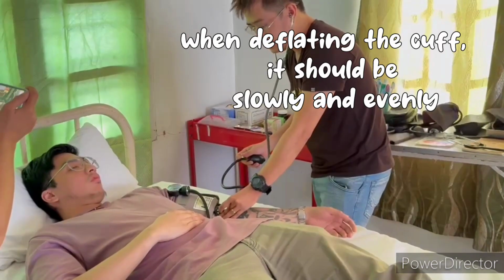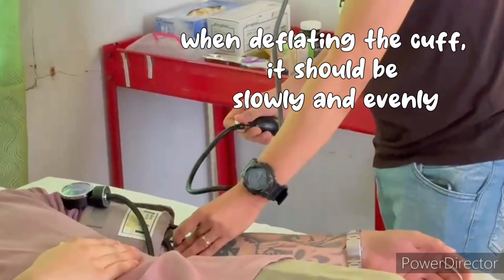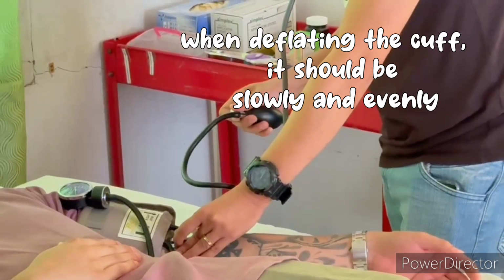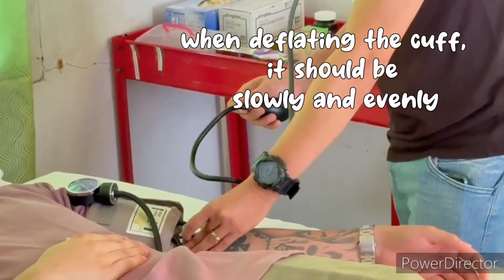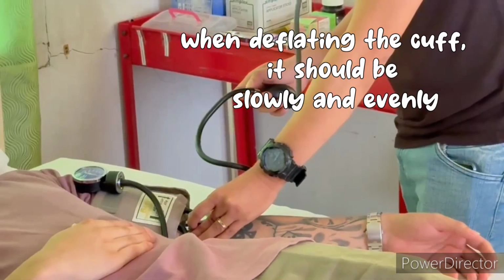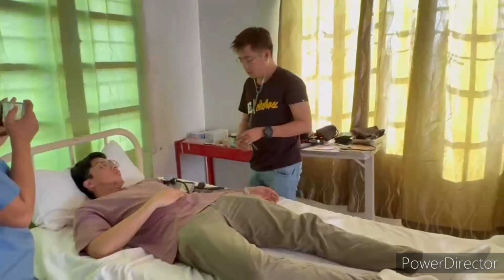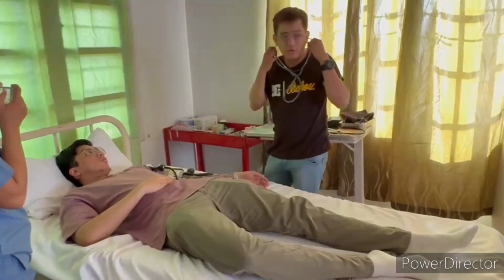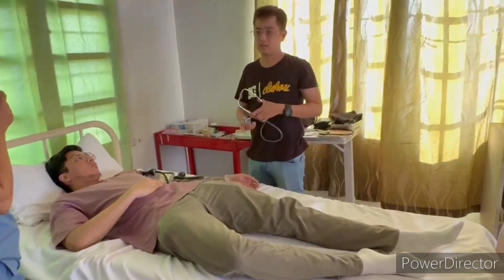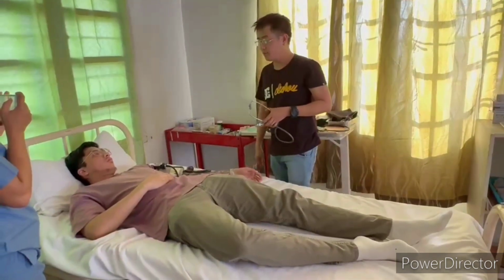And then when deflating, using the valve, you have to make sure that it's slowly and evenly for us to be able to get the accurate result of the blood pressure. Okay? If you're not sure about the result, you may try to get the blood pressure again, do the same procedure after 20 to 30 seconds. Or you can transfer to the other arm of the patient for you to get the blood pressure of the patient.